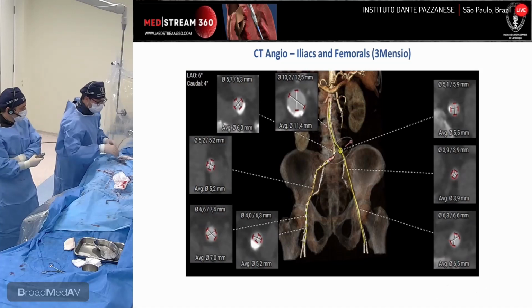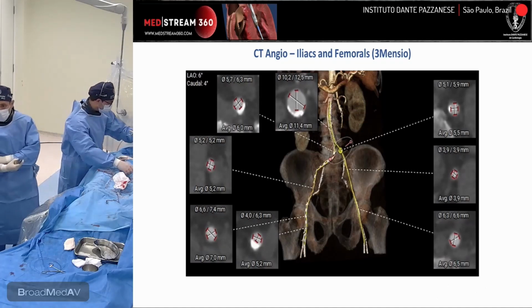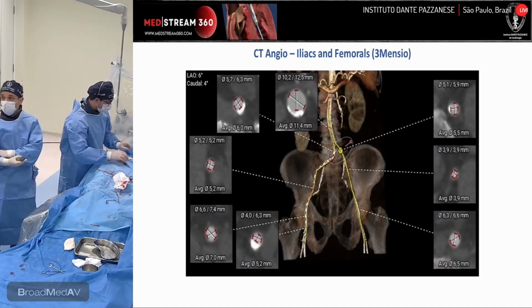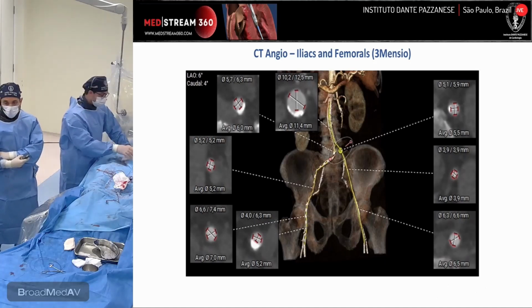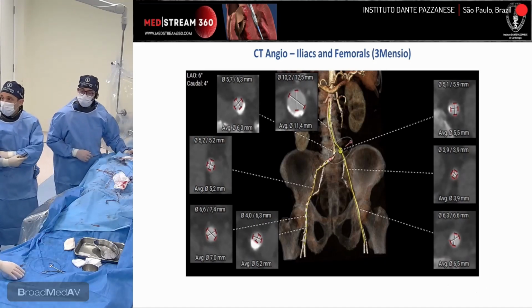And after we gave some protamine, we're going to perform a final angiography at the end just to look for any problems.